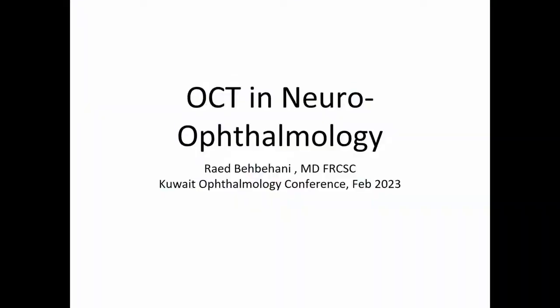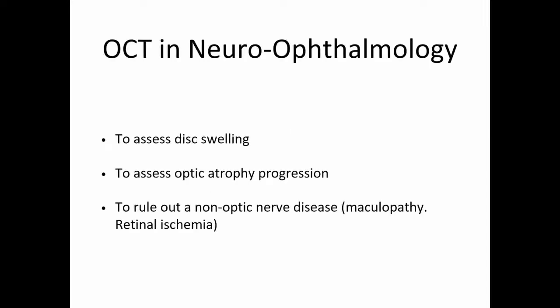Okay. So those of you who have been here early today probably listened to lectures about OCT and glaucoma. Never think about OCT in neuro-ophthalmology. Actually, there's a huge role for OCT in neuro-ophthalmology right now. And if you think about what happens to the optic nerve, it can either swell or atrophy, right? And this is what we use the OCT for, to monitor changes in the optic nerve.